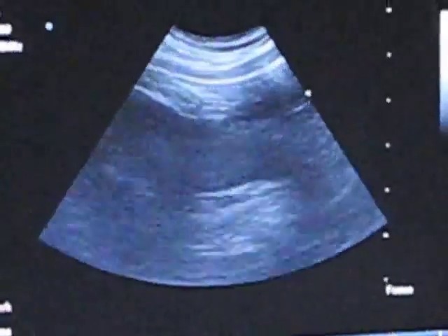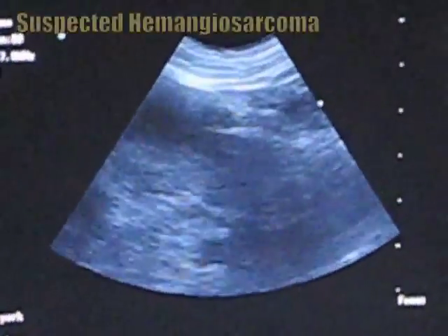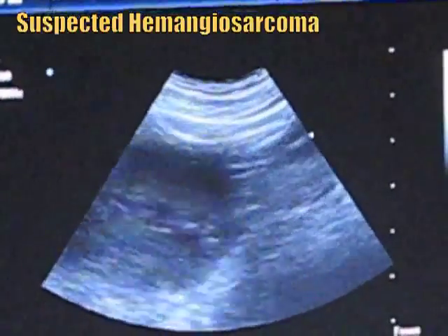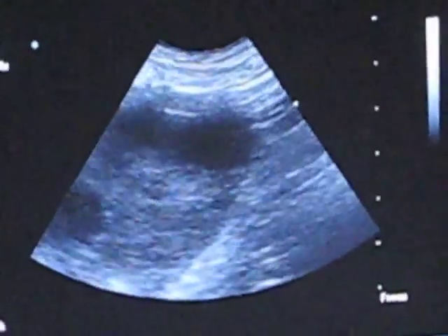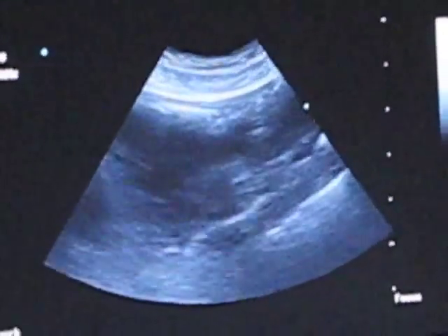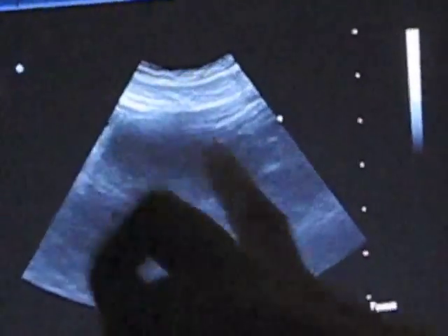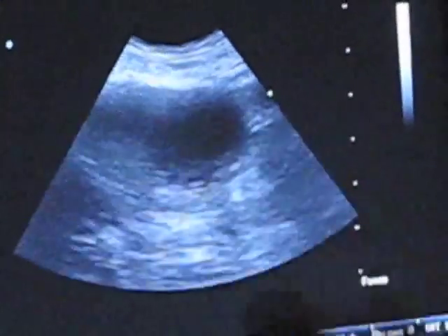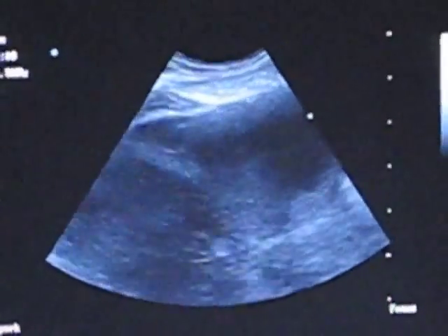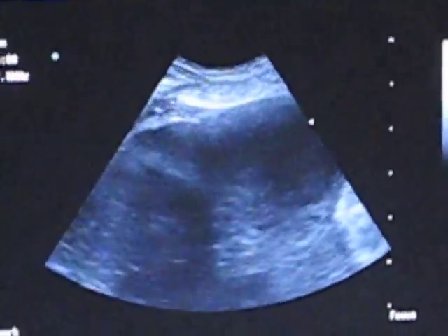When we come down here, we have this kind of rougher looking area — actually that might be a bigger area that shouldn't be there. The dark area. Fluid in x-rays and ultrasound is opposite: fluid in an ultrasound is black, whereas gas on an x-ray is black and the organs are white. So this is actually cavitated areas — see, it's kind of round here, and that's an area that actually might be getting ready to burst. That's what happens — the blood vessels kind of all go together. They're filled with actual blood, because the spleen filters the blood.